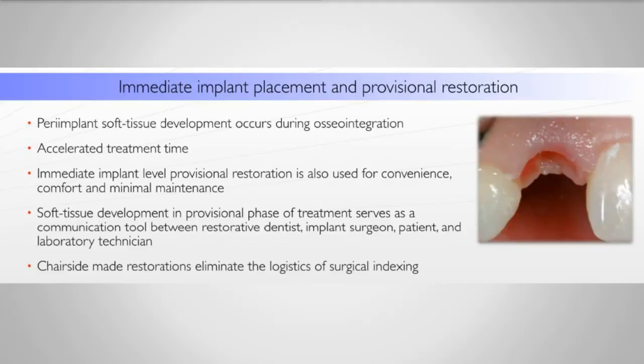It's also a great communication tool, not only between you and your laboratory, but you and your implant surgeon, be it a periodontist or oral surgeon, and of course between you and your patient. And it eliminates the logistics of having to use a surgical indexing technique where either your surgeon is going to have to do that for you or you have to be present at the surgery.